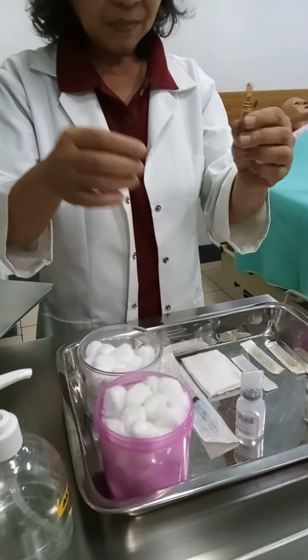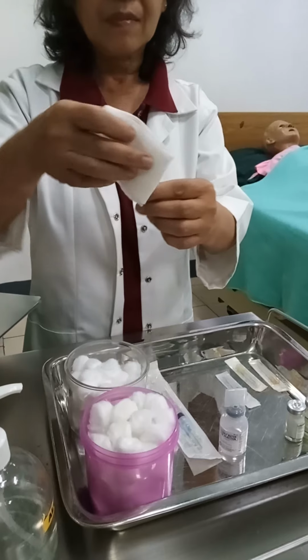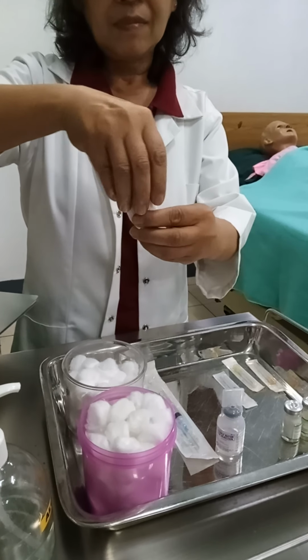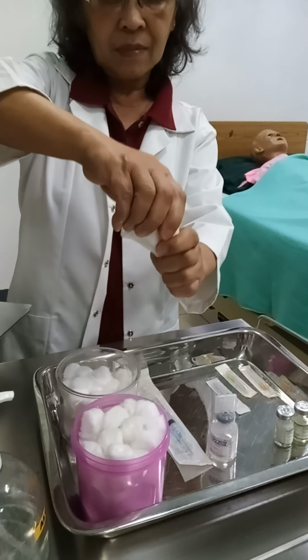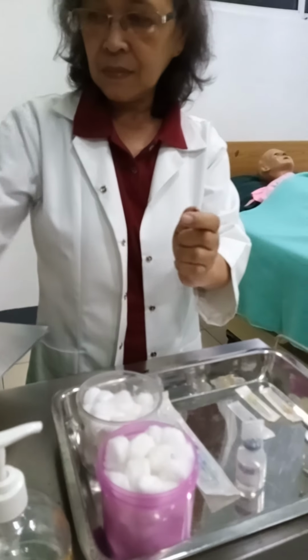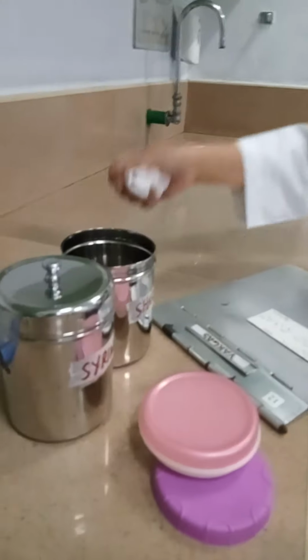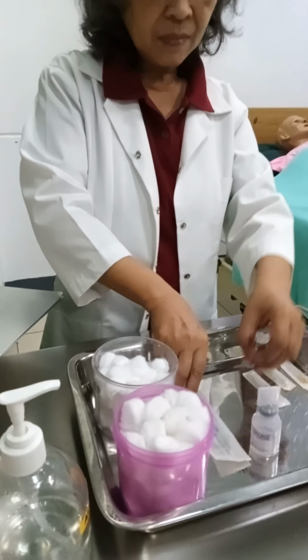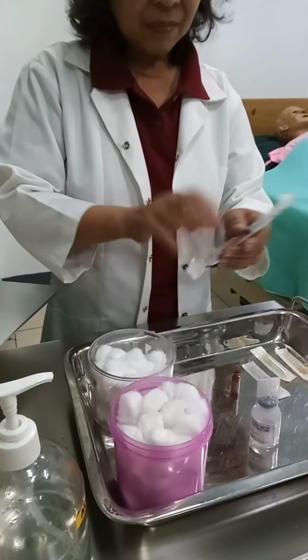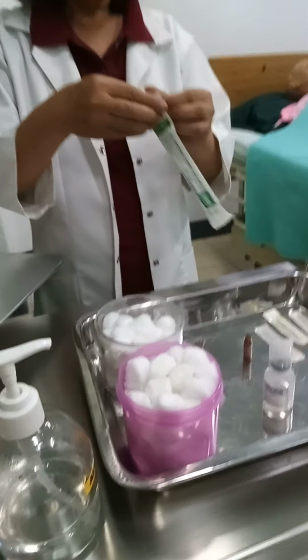Place a small gauze around the neck of the ampule. Snap the neck of the ampule quickly and firmly away from your hands. Hold the ampule upside down or set it on a flat surface.